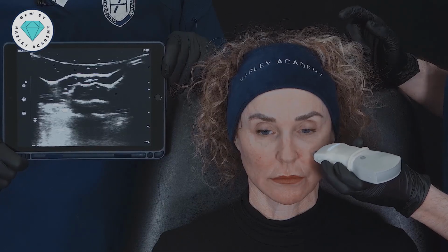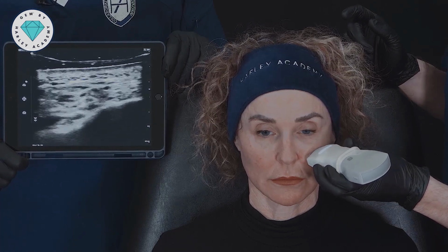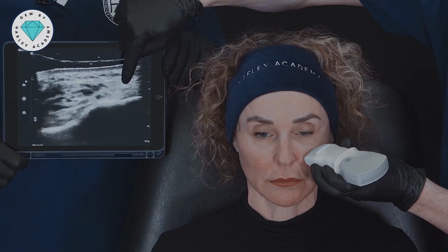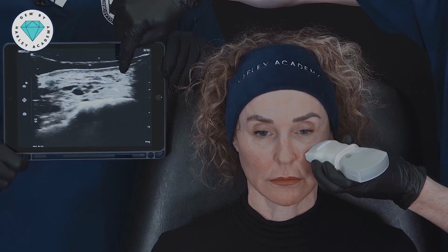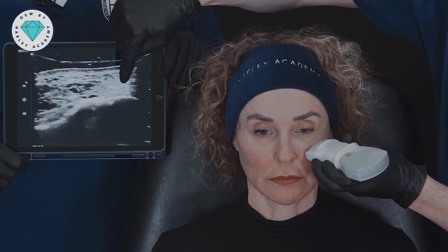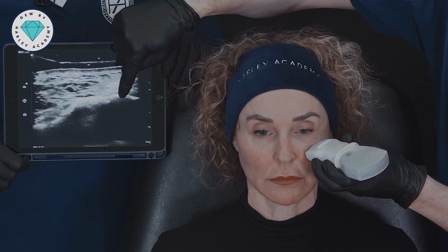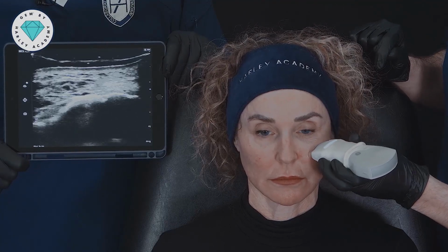So we're going to start over the medial cheek here. There we go. What we can see just on this side here is the zygoma. We've got the dermis, and our subcutaneous fat underneath. We can just about make out the SMAS on the screen here. Then we'll have our deep fat and then our bone, which is that bright white structure there.